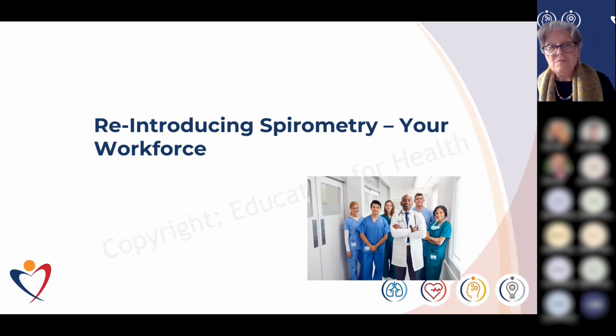So reintroducing spirometry, your workforce, you and me, us, what do we need? Key to quality assured diagnostic spirometry is the establishment of a national register of certified healthcare professionals and operators. We need to be able to demonstrate to commissioners, employers and patients that we can perform and or interpret spirometry to quality assured standards, and that we have a current certificate of competence.